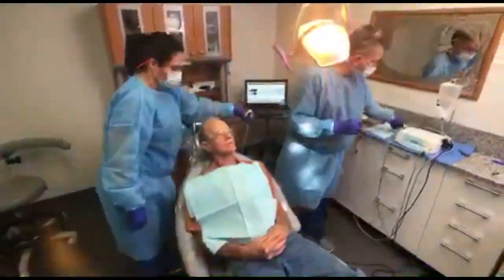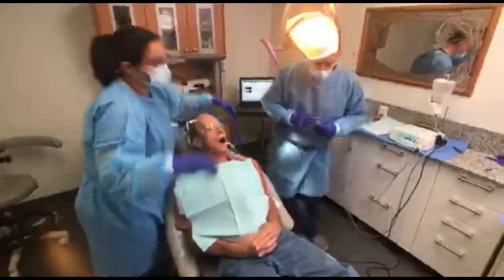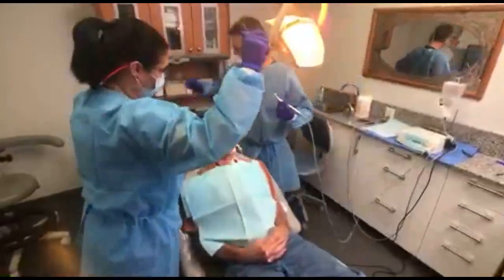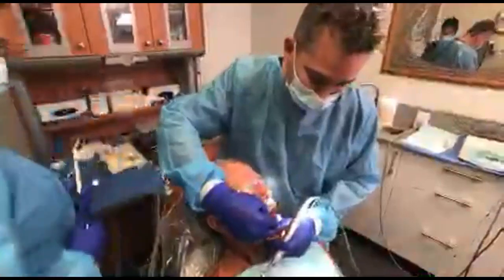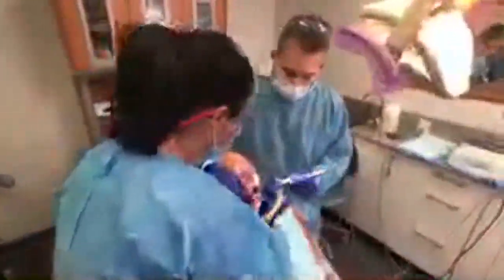Now what I'm going to do is go ahead and widen the hole. Once I widen that hole, we're going to put our implant in place — it's exactly the same technique. Open as big as you can. We're going to use the same angulation and everything.